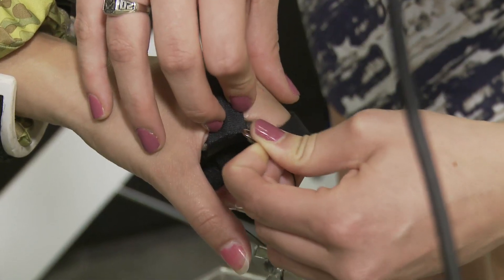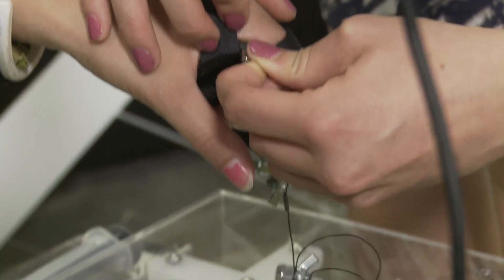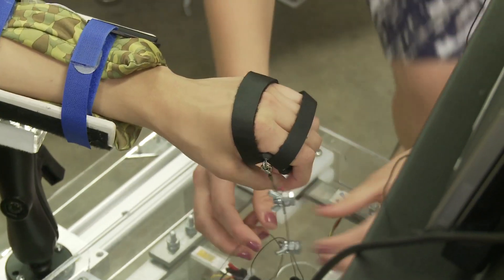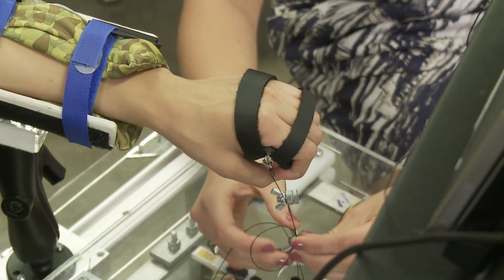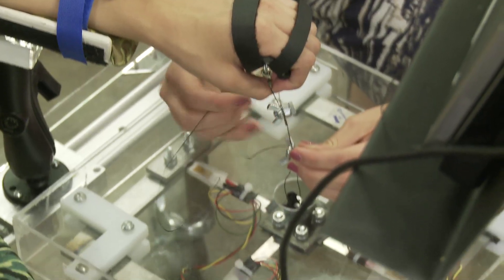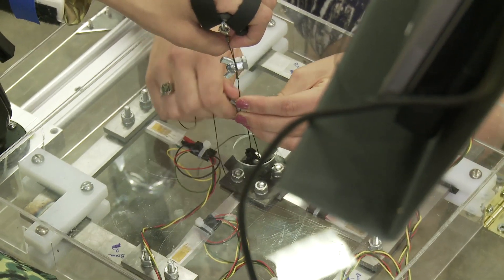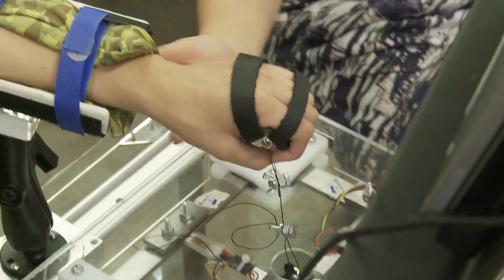We then use steel cables with lobster clips, kind of like a necklace, to attach it. These custom screws have holes in them, which allows us to adjust the length of the string as well as the angle of the patient's hand very easily to match the patient's physiology.